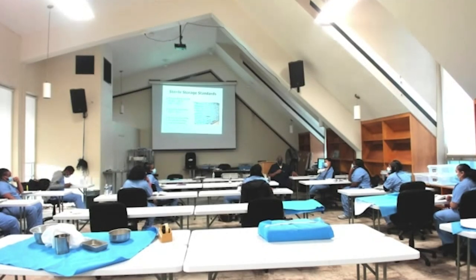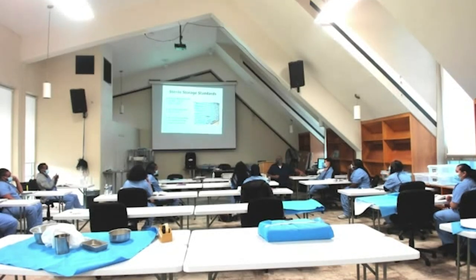You want help? What would you do? That is what you would do, and that is correct. She said, give me that tray back. She said, before you send that tray to the OR, let me open it up again in our department where if this was missing, I can fix it. Hold on, one at a time.